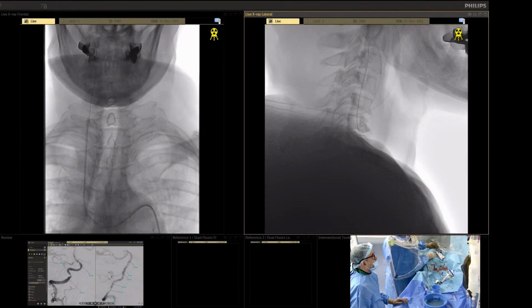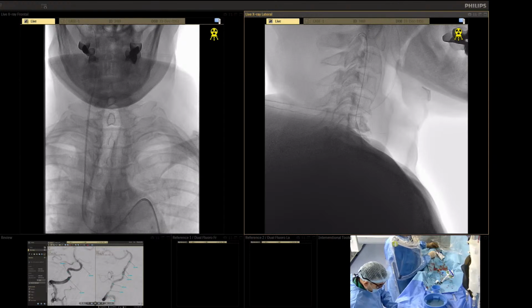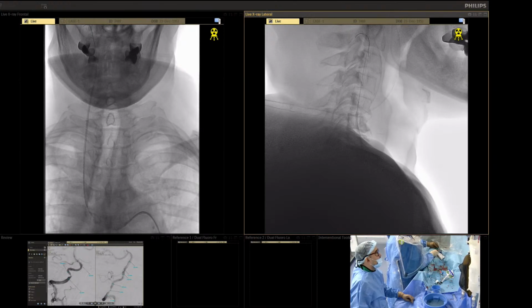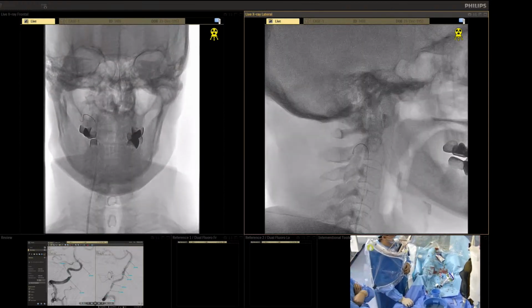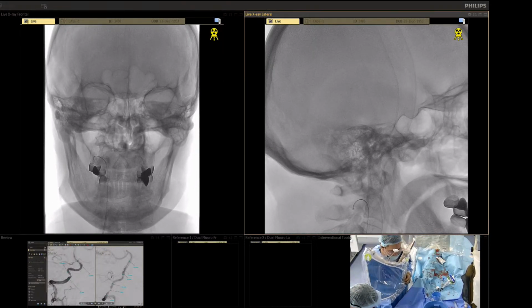Now it should go, huh? The alternative way is to leave the 35 wire inside and do it with zoom.